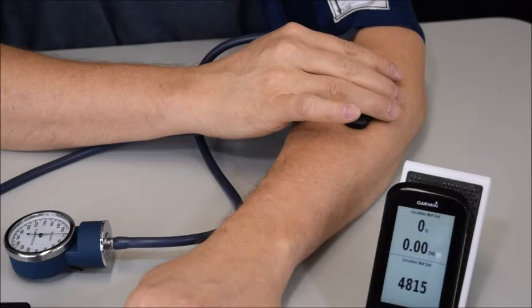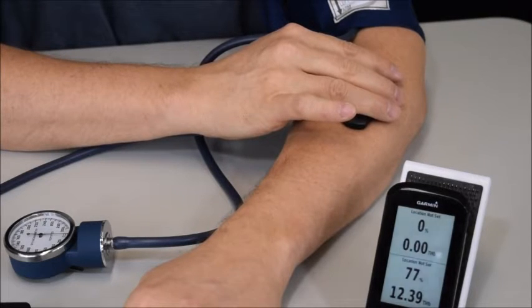I'm not sure I'm always using this device correctly. Sometimes it takes a long time for it to get the first reading. There it goes. So a very normal number, reading a 78 or so. Now it might bounce around here a little bit till it gets its smoothing filter or smoothing buffer filled up. But this is a pretty common resting number. So we're seeing right around 77, 78 in there somewhere with the competitive device.